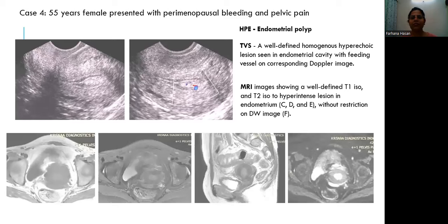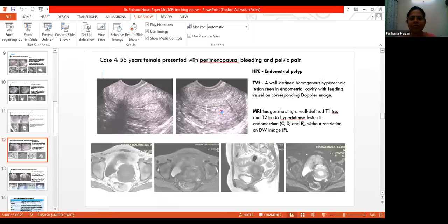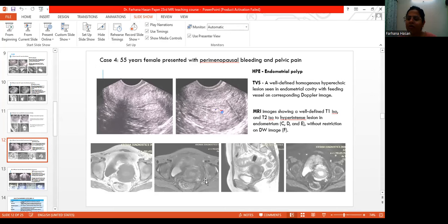Case 4: a 55-year-old woman presented with perimenopausal bleeding and pelvic pain. On TVS, a well-defined homogeneous hyperechoic lesion is seen in the endometrial cavity with a feeding vessel on the corresponding Doppler. On MRI, we have a well-defined T1 iso, T2 iso-to-hyperintense lesion in the endometrium without restriction on DWI images. An endometrial polyp was diagnosed on histopathological examination.